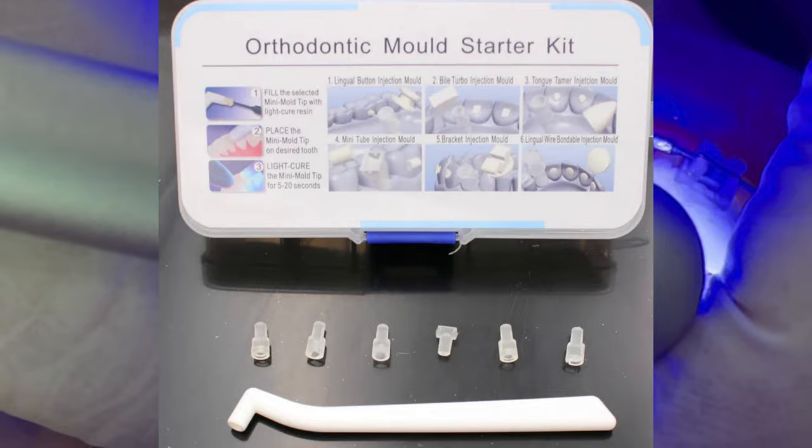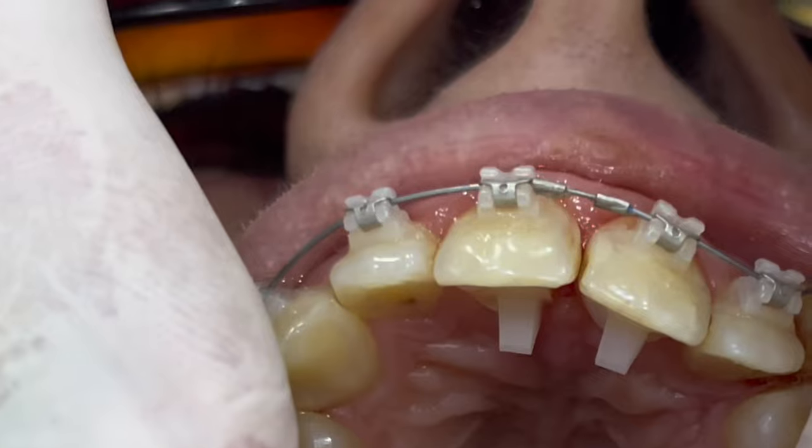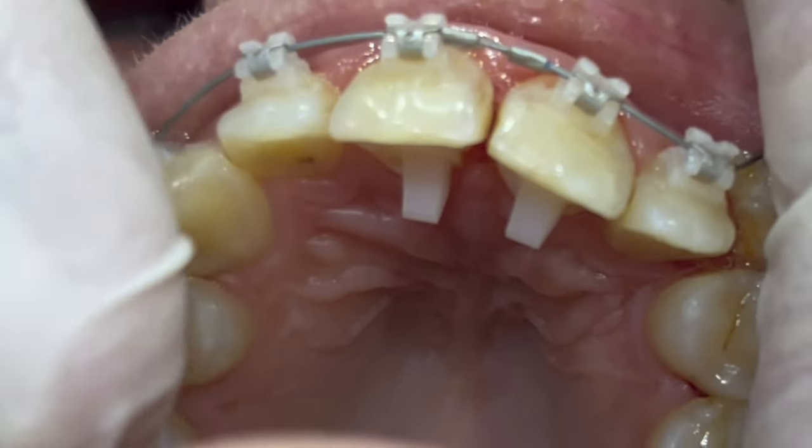Another use for that mold starter kit — as you see in this photo, there are different types for different purposes, such as lingual button, and small brackets, etc.